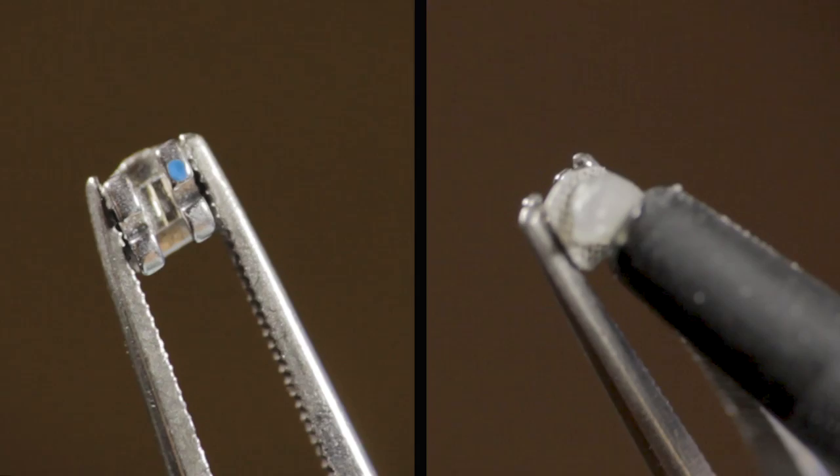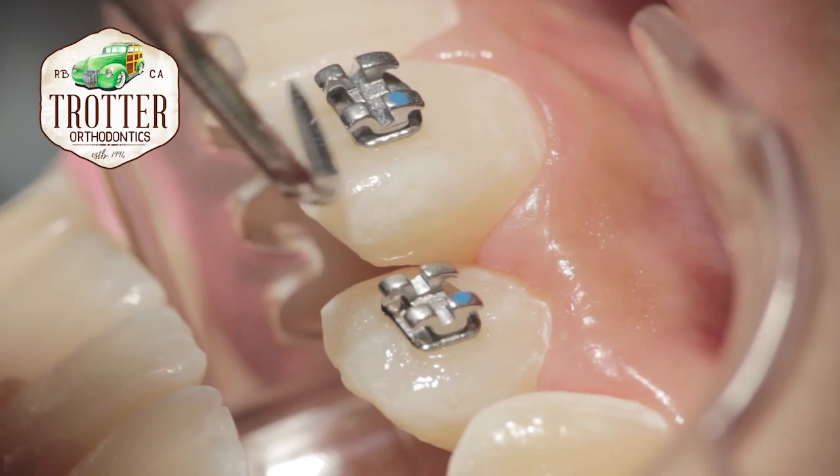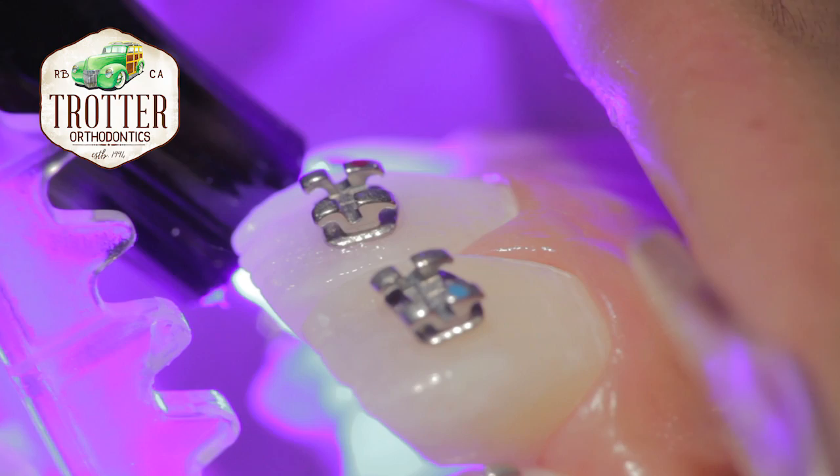Glue is applied to the back of the bracket. Each bracket is placed onto the position of the tooth that is optimal for the wire to be able to move the tooth into its final position. The excess glue is removed from around the bracket, then ultraviolet light is shined onto the glue to cure it.